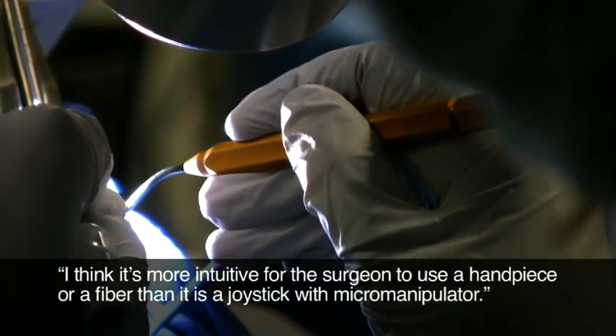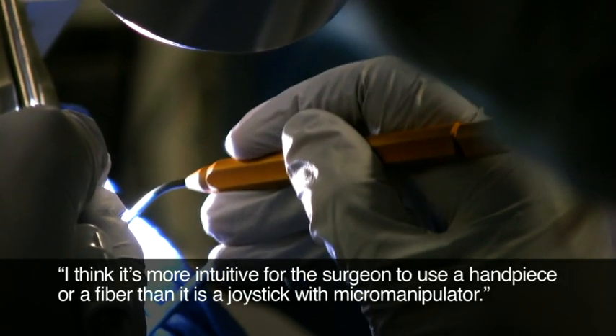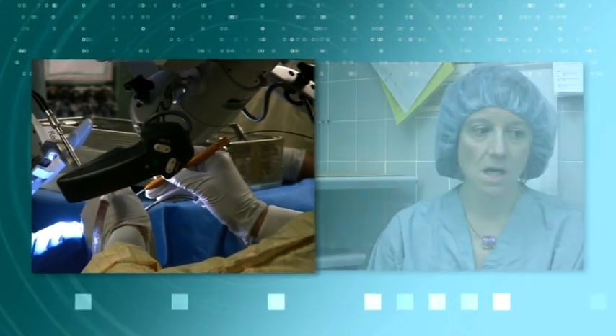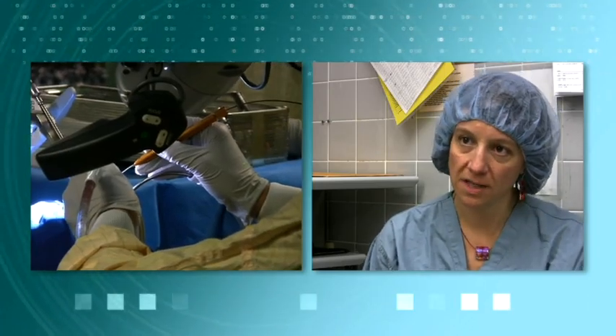I think it's more intuitive for the surgeon to use a handpiece or a fiber than a joystick with micro manipulator. I find when I use the waveguide I have more flexibility — I can get in spaces that are tighter and harder to access. There's also a feeling of safety when I use the waveguide because I feel very confident that I know where the beam is at all times, almost as if I'm more in control of where the laser energy is being delivered.